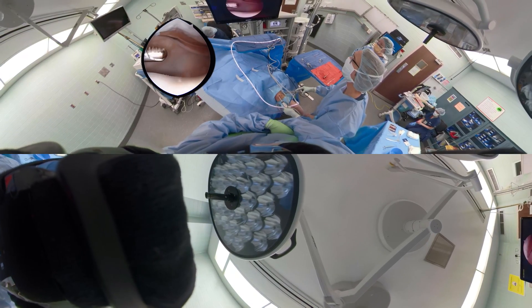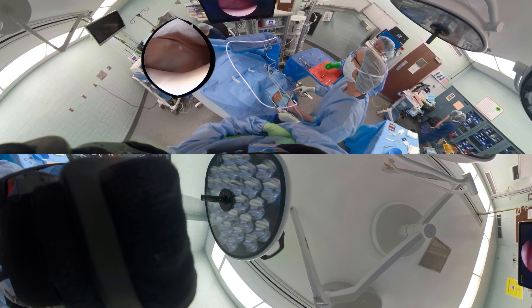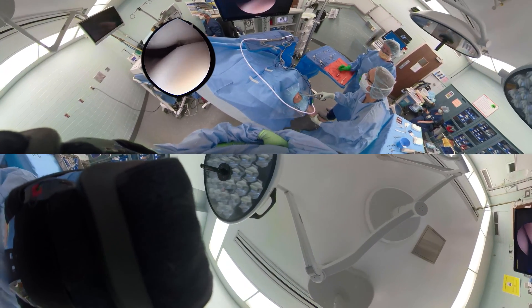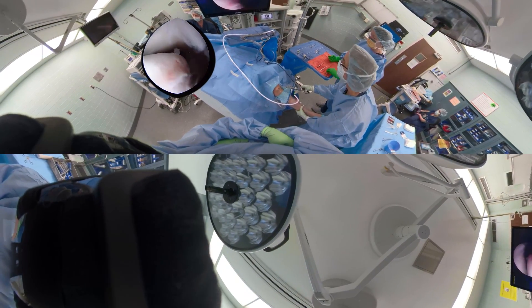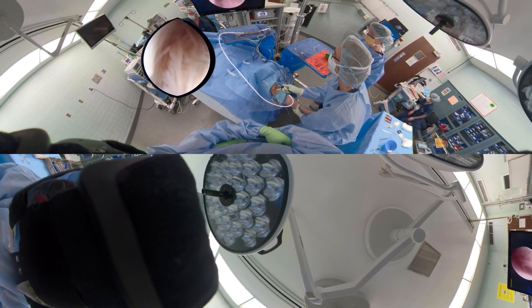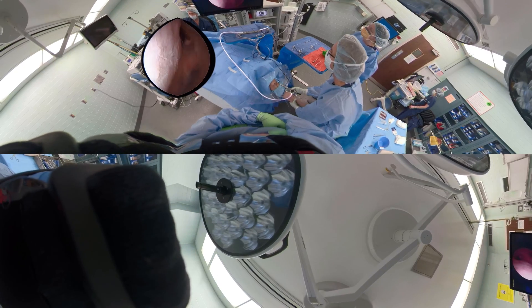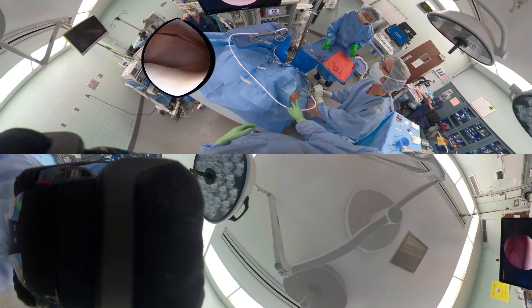That's where the loose body came from when she dislocated her patella — the patella goes out laterally, into the trochlear groove toward the lateral femoral condyle, and then comes back. We're looking at the tracking with the scope in my right hand, switching the light cord around, looking down into that lateral gutter to see if there are any further loose bodies, with the knee resting on my upper thigh.